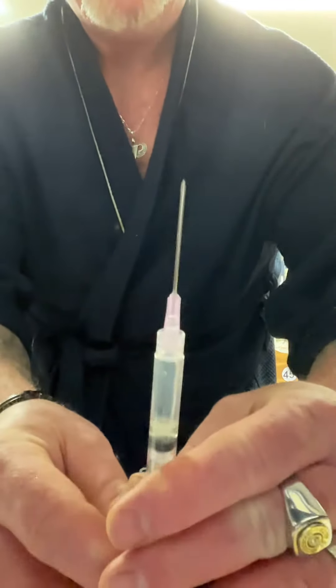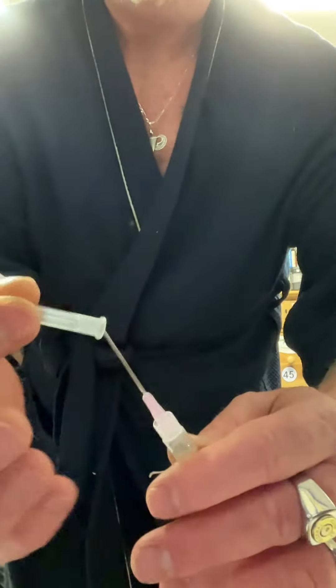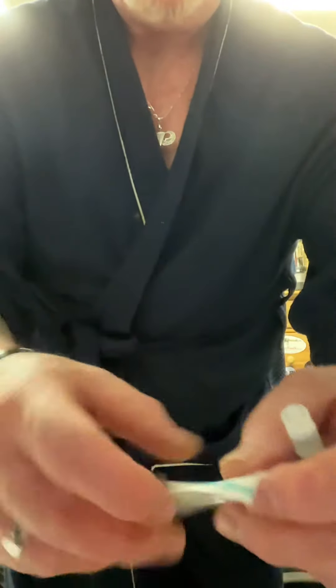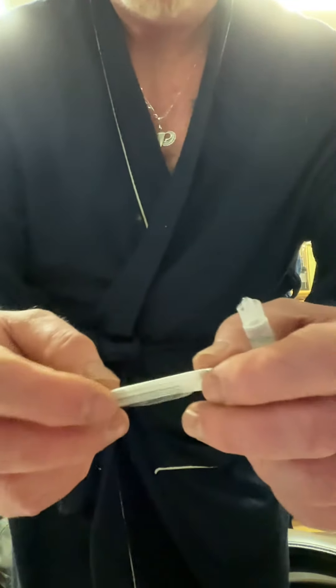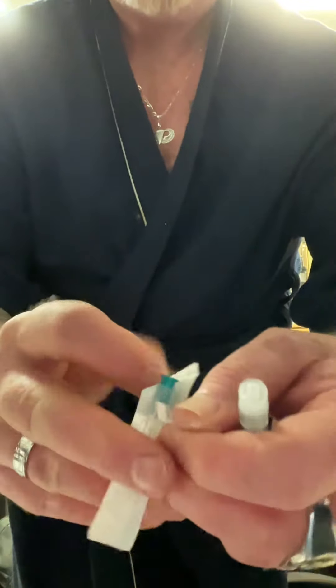Once that's in there, I go ahead and get the air out — not all the air, but most of it — put the cap back on to discard this. And then I go to the 23-gauge, which is the one I'm going to use to inject. Much thinner and no pain.